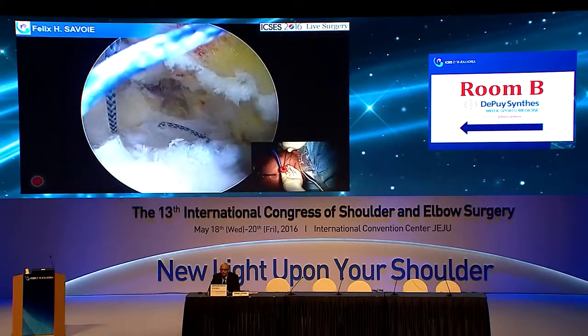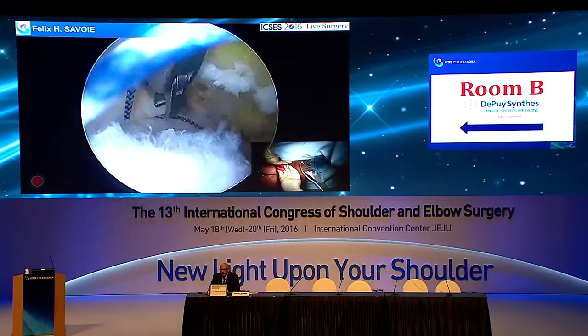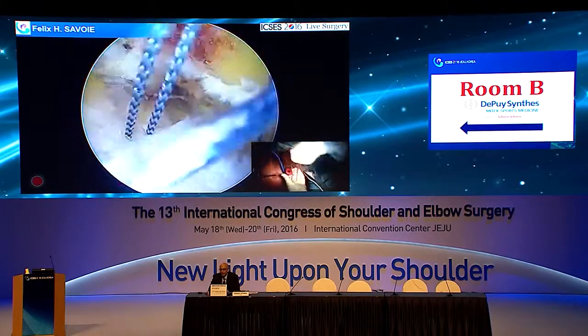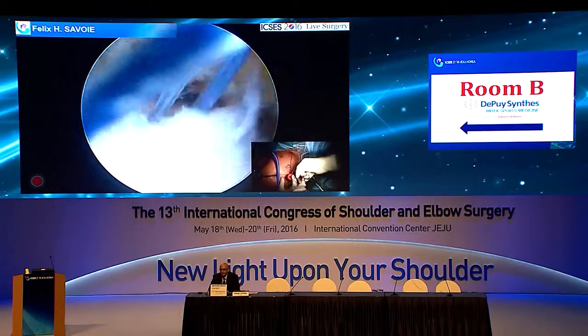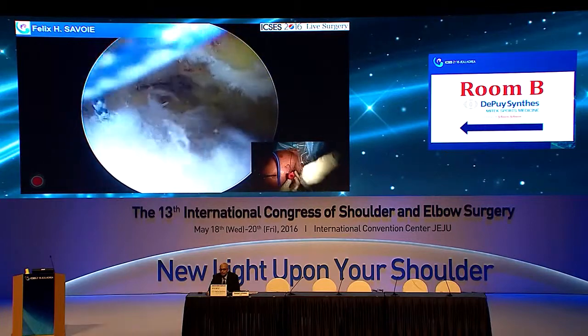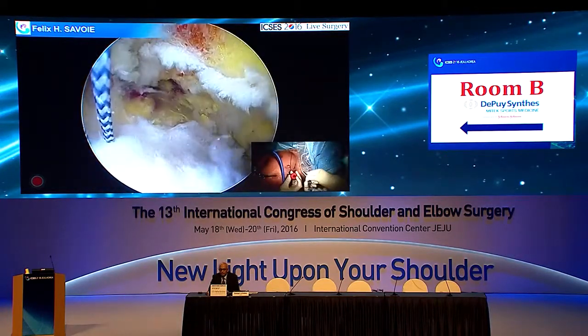So that's the front one. That's in supra. This is the back one. That's in infra. So then we'll tie this one. Thank you. And the suture this time will be on the front, and in the back one it'll be on the posterior one because we want to make sure we shift that up.